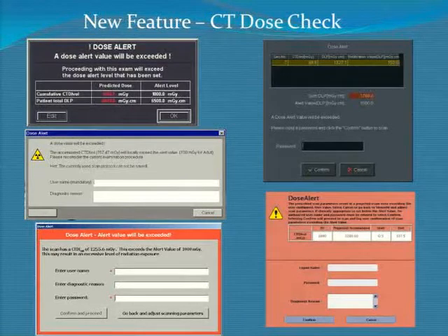So I would strongly suggest, if you think you're ever going to be in that situation, to test it out. The other people that tend to run into this are physicists during annual testing, because you set up a big long set of runs, and all of a sudden you get to the point where it won't go any further. But I would suggest doing that and making sure that your password thing actually works, so that in a clinical situation you're not scrambling around like we were, because that was kind of ugly.